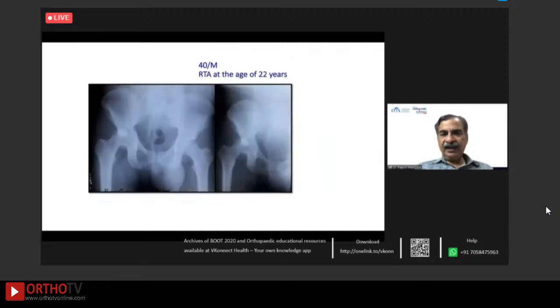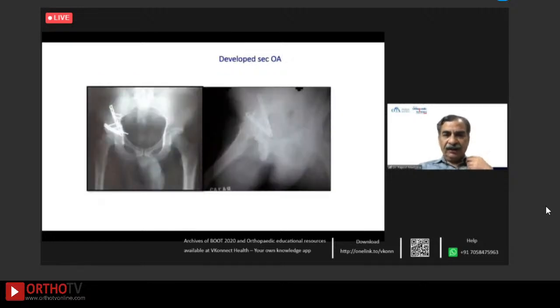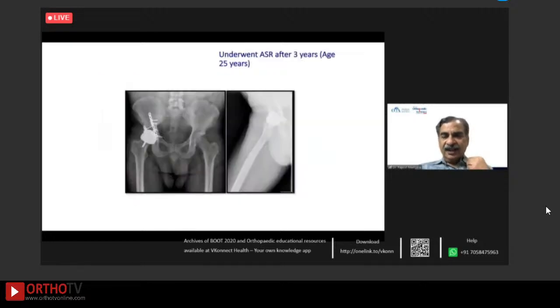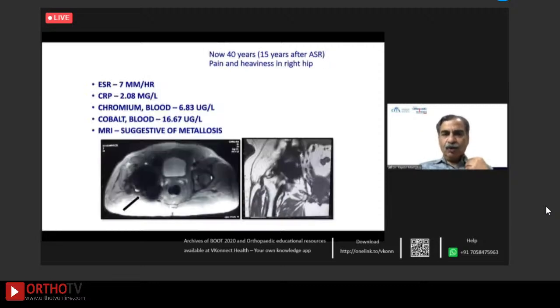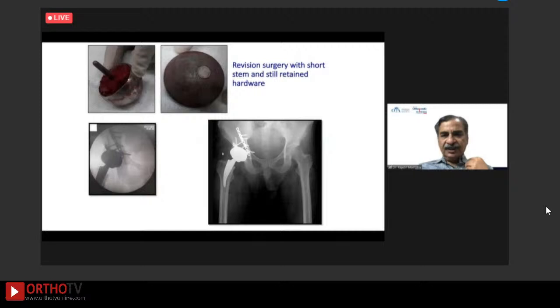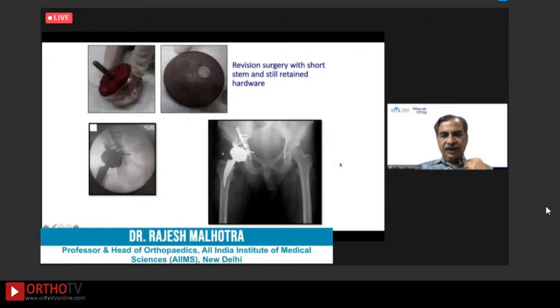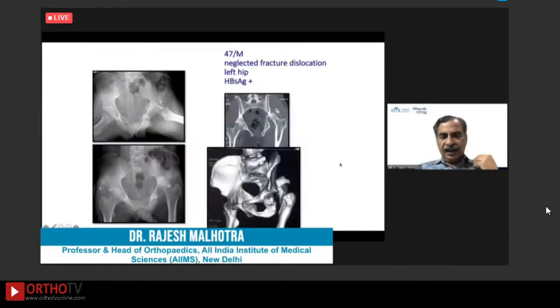A 40-year-old male, road traffic accident at 22 years of age, underwent ORIF, developed secondary osteoarthritis, underwent resurfacing after 3 years. And this lasted him a good 15 years when he presented with pain and heaviness and a big pseudotumor. And this was a revision surgery because he was very young. He was revised with a short stem and continues to do very well.